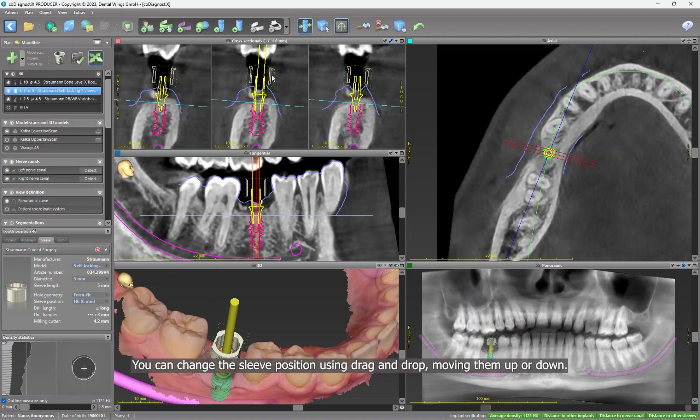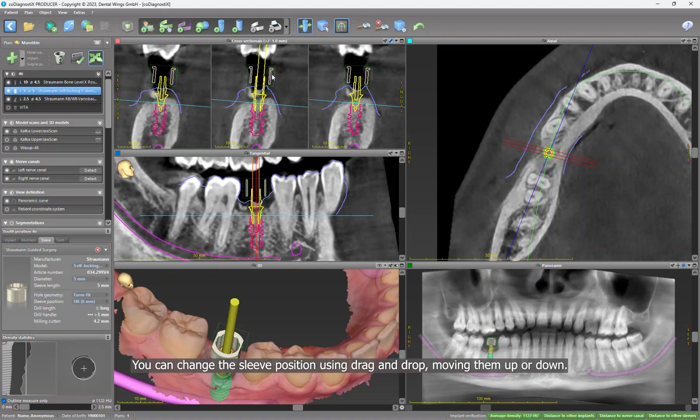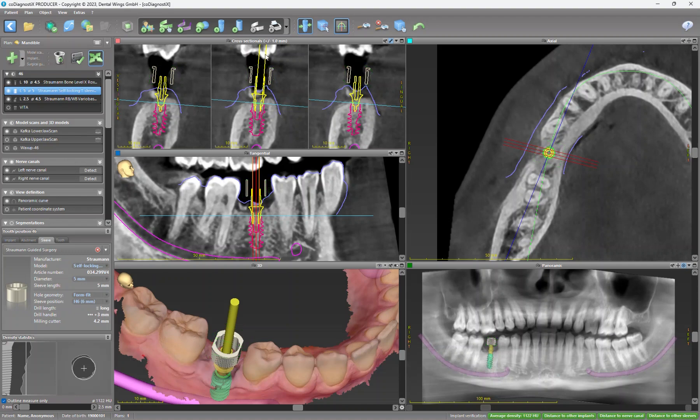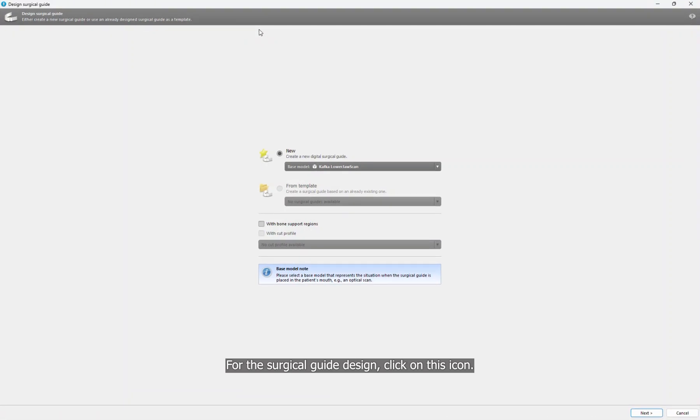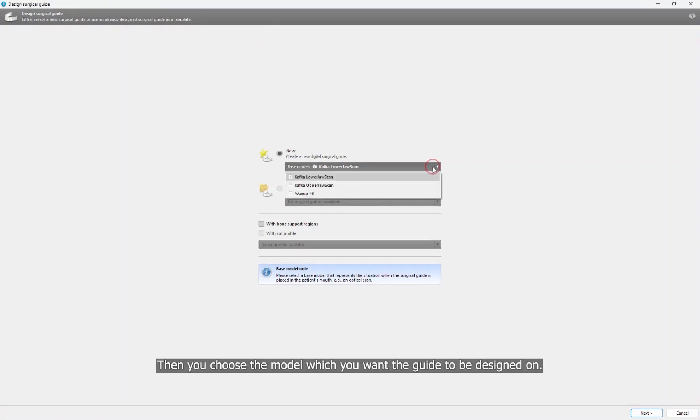And when closing this window, the sleeves are set for the implant. You can change the sleeve position using drag and drop, moving them up or down. For the surgical guide design, click on this icon.